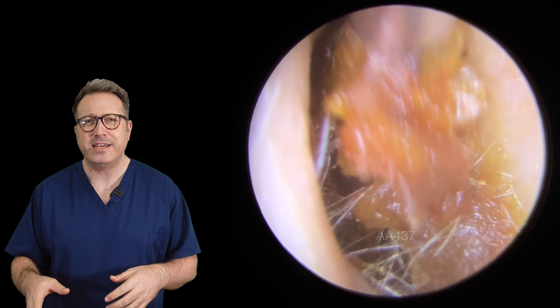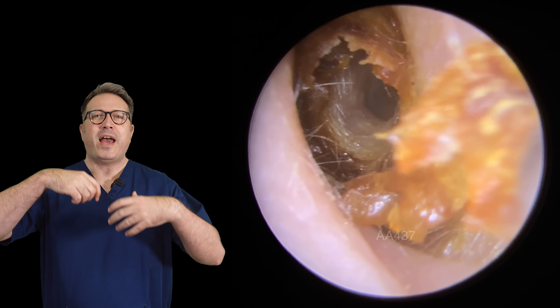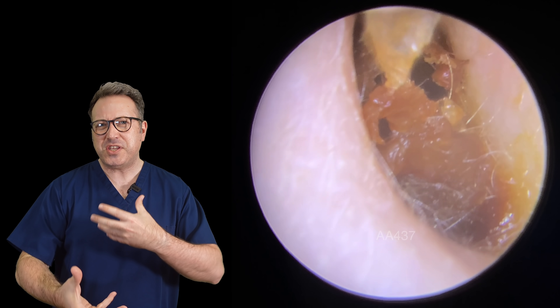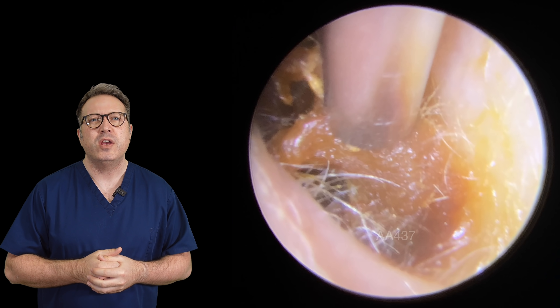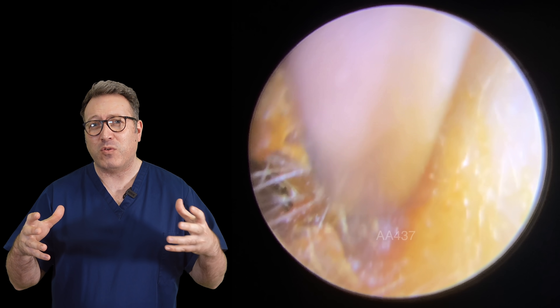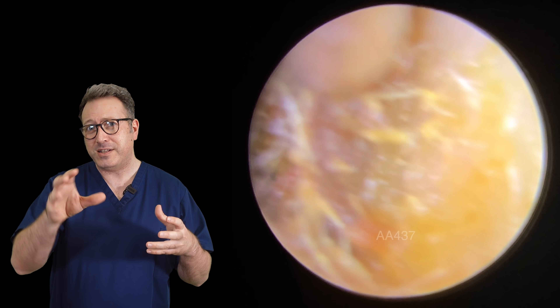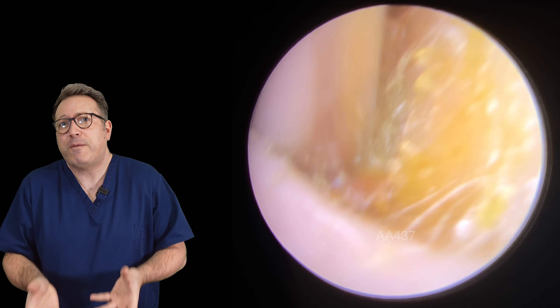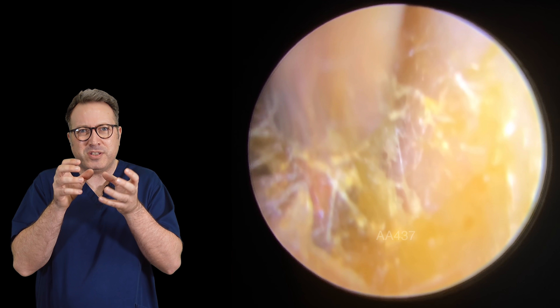The first patient has come through feeling very, very blocked up. We've got a mixture of dry skin and old dry wax in here as well, so it's really firmly held onto the canal walls. We've got the standard size on the tube in here. You can see we're fighting with this little bit of the entrance here — I'm trying to peel this off the canal wall so we can get those much deeper bits.